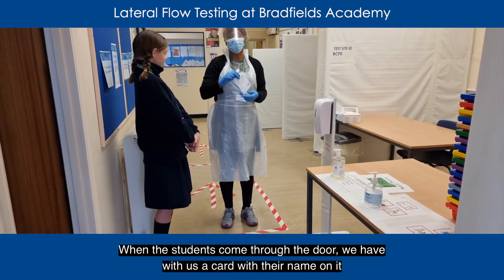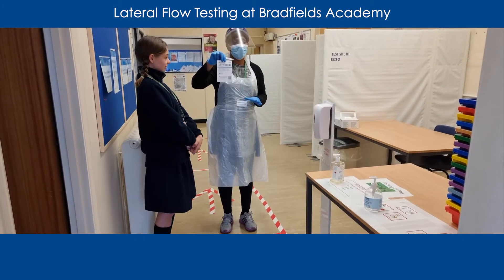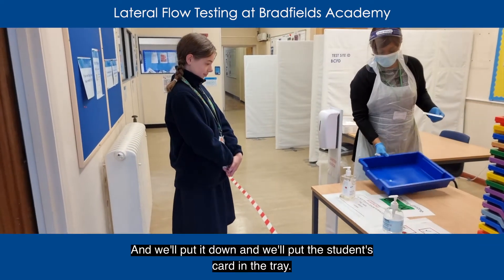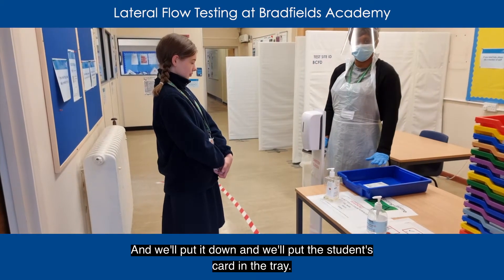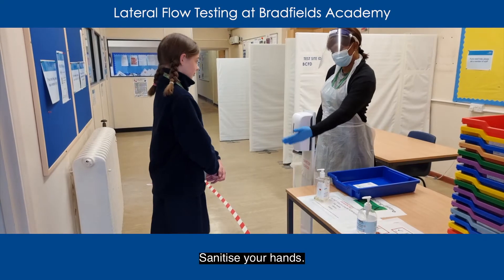What we do is we get one of these trays here and we put it down and we put the student's card in the tray. After we ask the student to sanitise their hands.